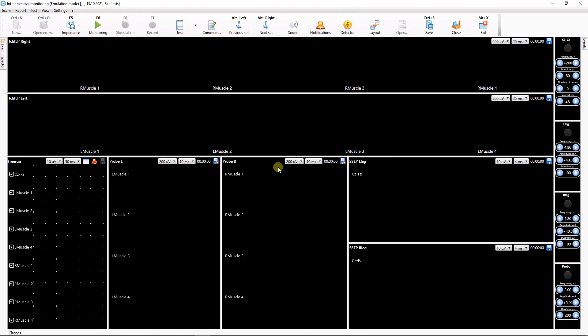Today we'll talk about Stimulation programs. A Stimulation program is a powerful tool designed to streamline the monitoring process through its automation. The Stimulation program allows programming the sequence of stimulator operation.